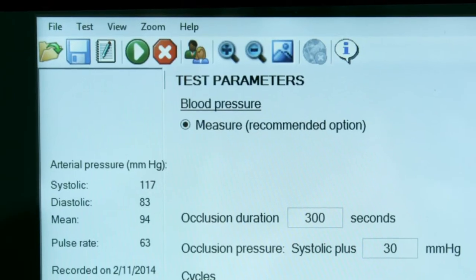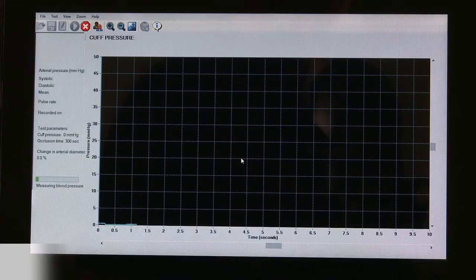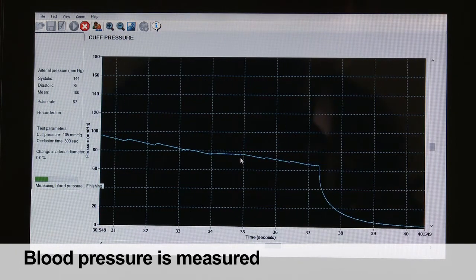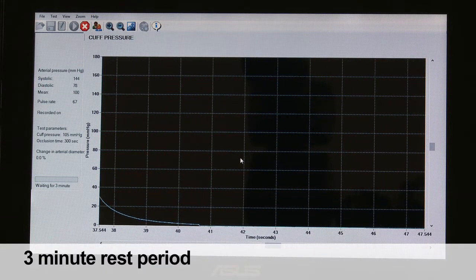After the 10-minute rest period, the testing proceeds as follows. The test is initiated by clicking on the start button. First, the system takes a blood pressure measurement. Blood pressure will then be displayed on the screen. Shortly after, the cuff deflates and the system then provides a three-minute rest period.